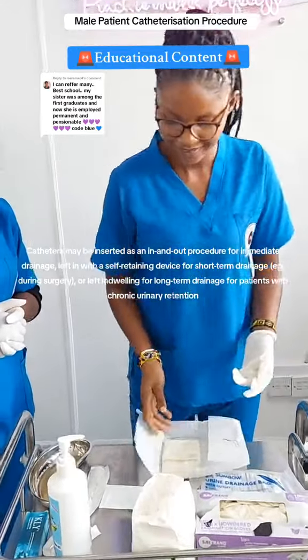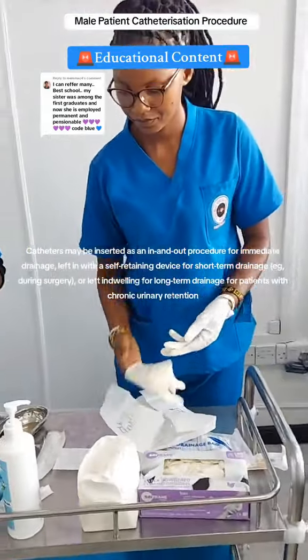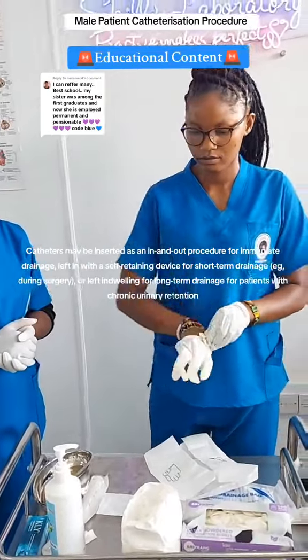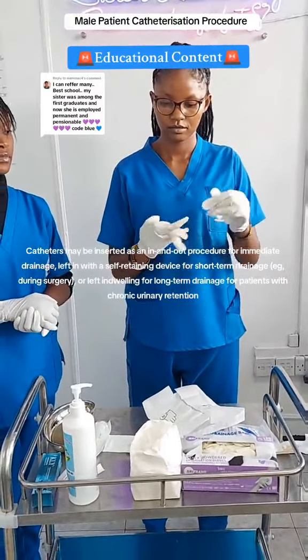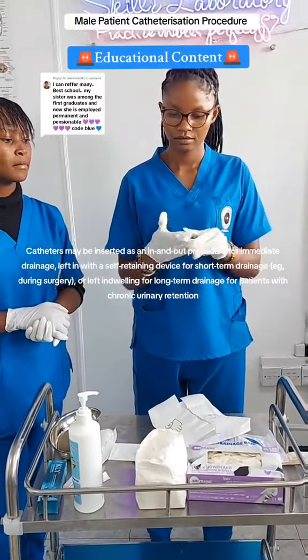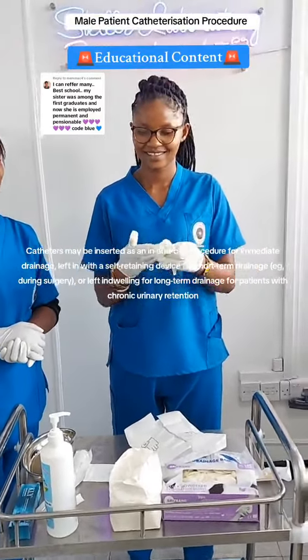Catheters may be inserted as an in and out procedure for immediate drainage, left in with a self-retaining device for short-term drainage, e.g. during surgery, or left indwelling for long-term drainage for patients with chronic urinary retention.